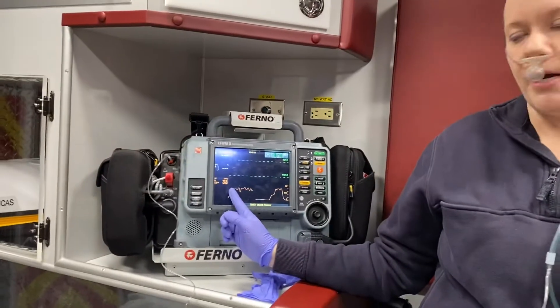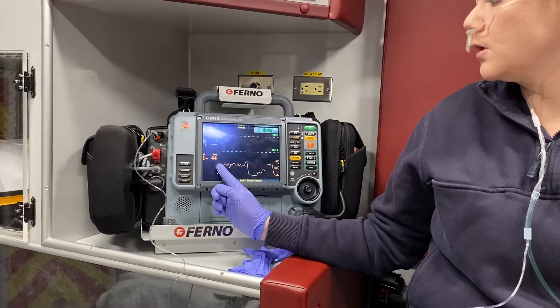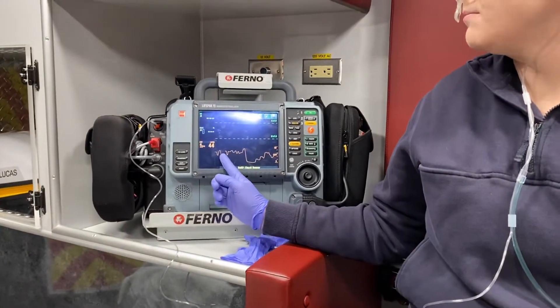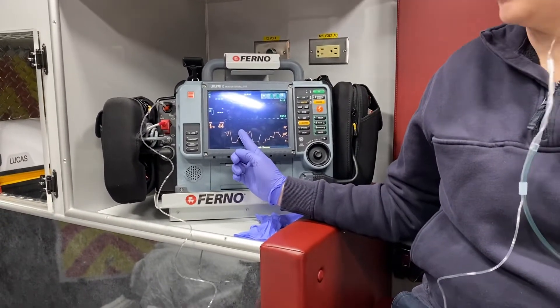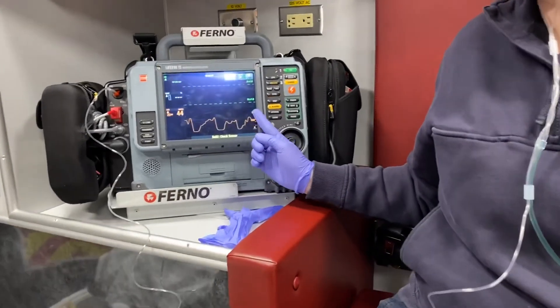Once they take a couple of breaths, you can actually see their capnography reading on the monitor. We do want it to be between 35 and 45. My rate is a bit all over the place because I'm speaking, but if I was just sitting here breathing normally, you would see a nice plateau — a normal capnography reading.